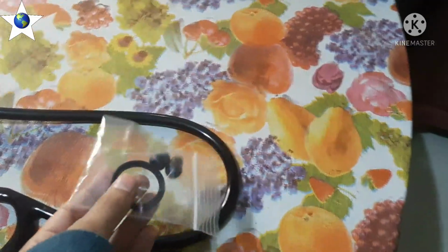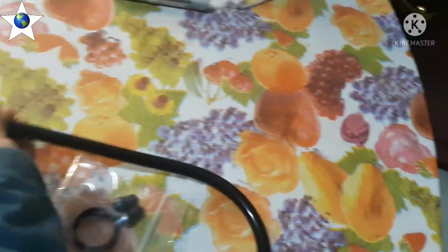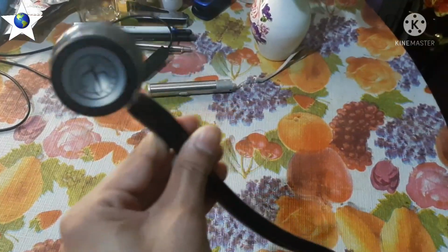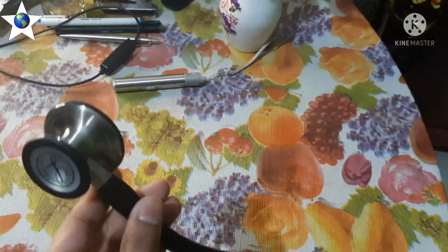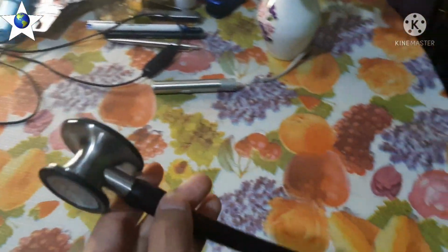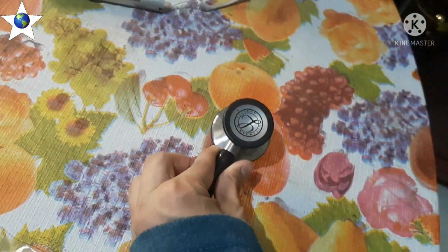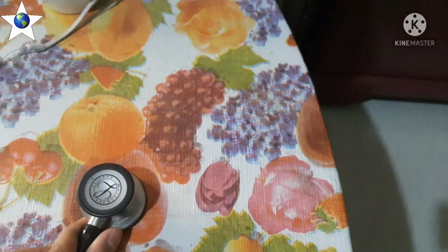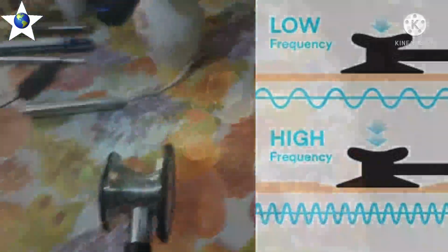One ring is there, and this ring is used when you want to convert this pediatric side into a traditional bell. Now we know that a stethoscope has two sides in the chest piece, one diaphragm and the other bell, but that was traditional, not the modern technology. Modern technology is tunable technology, and Littmann uses tunable technology. If you press your stethoscope lightly, you will hear low frequency sound, and if you press it firmly, you will get high frequency sound.